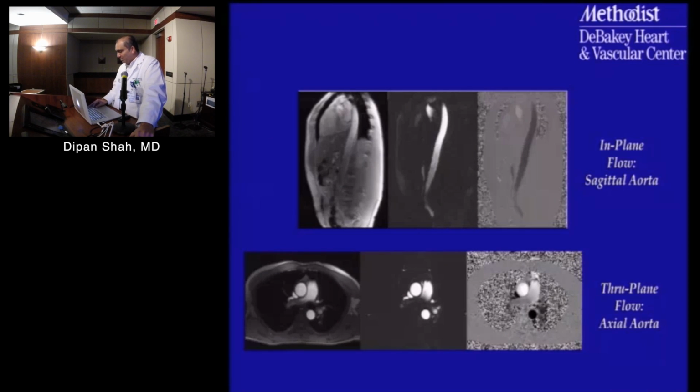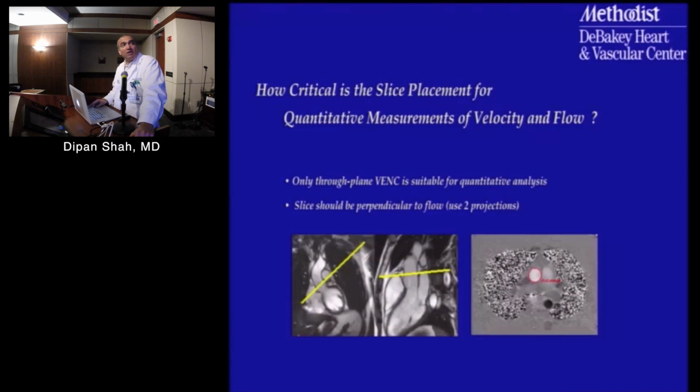And you try to adjust for that. Now with newer sequences, we have an intrinsic way to do that without having to take the patient off and put a phantom on. If I'm measuring the ascending aorta, I've got some stationary tissue that I could easily measure, which is the chest wall. So oftentimes we'll draw a region of interest in the chest wall and ask what velocity we are picking up there. Again, it should be 0. If you're picking up some velocity in the chest wall, you can tell the software to correct for the background velocity that you're picking up in some stationary object that's nearby. And so whenever we look at the data, we will get two sets of curves. One is without correction, and the second is with an offset correction based on whatever it measures for the background. So that's one of the ways that you can do offset correction.